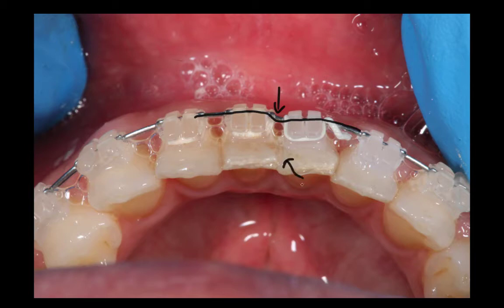This bit will probably just tuck in a little bit, just straightening out this incisal edge something like that. So all I've done is been very aware of where this incisal edge is and made the bracket positioning parallel to that. But also we've got this sort of vertical slot and that is in the middle of the tooth — it's much easier to rotate a tooth properly if the bracket is in the middle of the tooth. You could have done this probably with wire bending on stainless steel wires, but sometimes it's just a lot easier to debond, reposition the bracket in the right place, and just let the wire do its job.